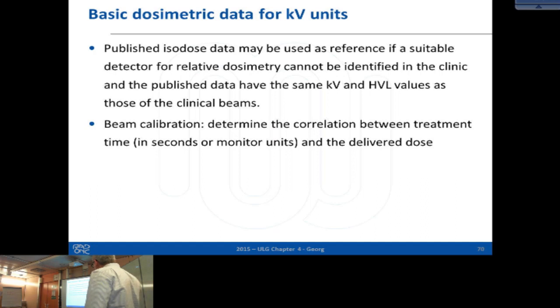And secondly, there are larger medical physics groups in the UK, and they have published big books about reference data: scattering factors, depth dose curves for many different units. They also provide tables as a function of beam quality specifier. So there you find a lot of reference data on how a beam with, I don't know, 3 mm copper half value layer should look. And when you do measurements and you're all alone on an island with an X-ray unit and have this book, you can do your measurement, you can trust yourself. Maybe you did good measurements, maybe less good measurements, but then you have a comparison of your performance with the rest of the world, if you have no other colleagues to talk to.